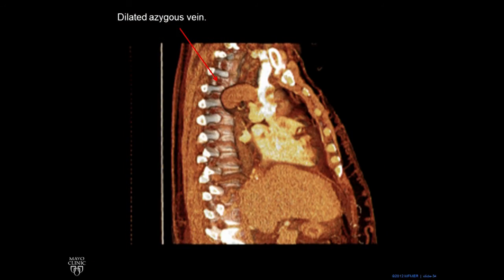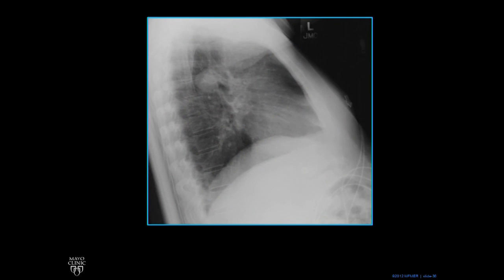Here you can see that this azygous vein drains into the SVC. The SVC is very white. And if you look, you can see the rest of the azygous vein running sort of anterior to the spine there. We overlay the lateral, and you can even see on the lateral the sort of bump of the azygous vein right where it was.